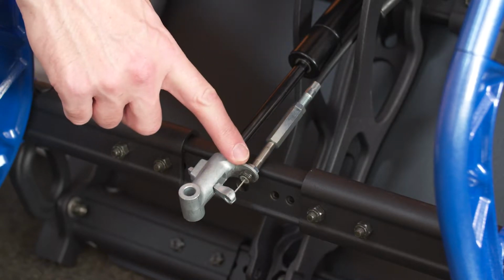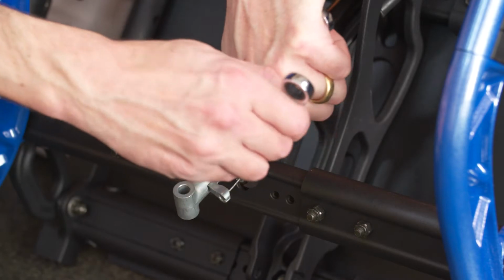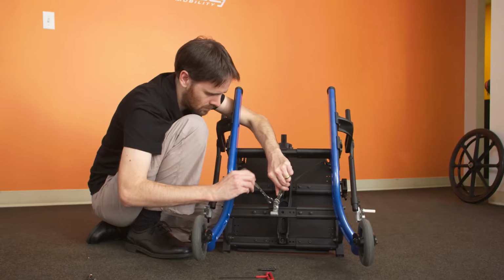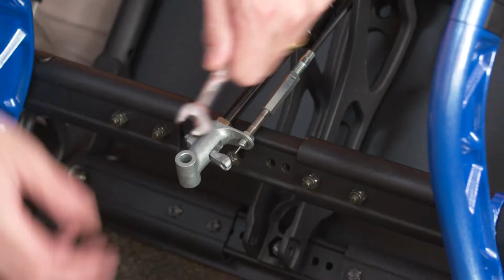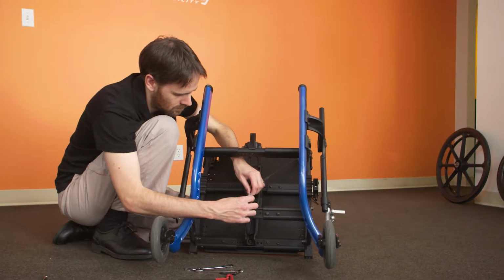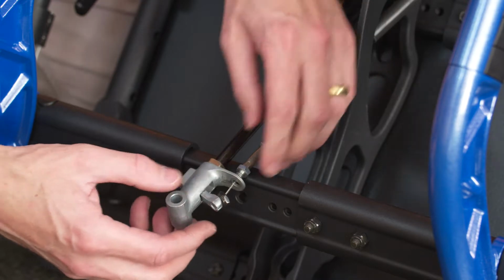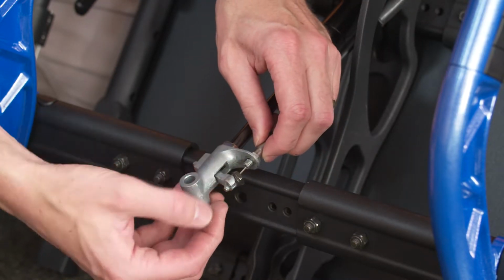Remove the cable mounting fastener and remove the cable. To ease removal and later reinstall, loosen the cable turnbuckle. Remove cable end fitting.